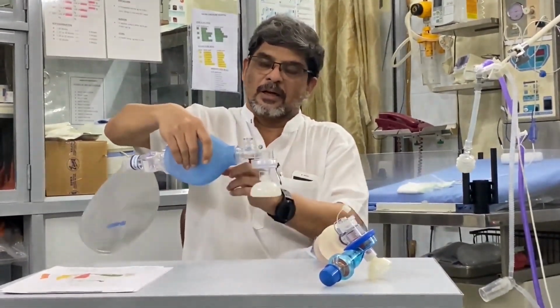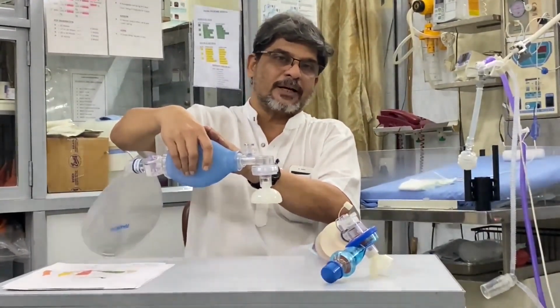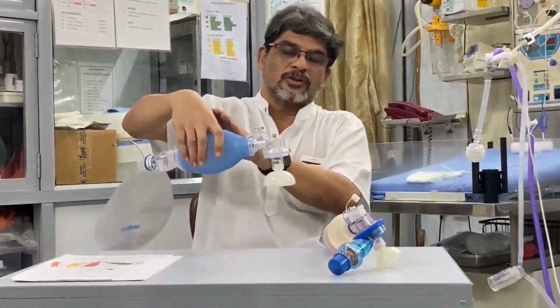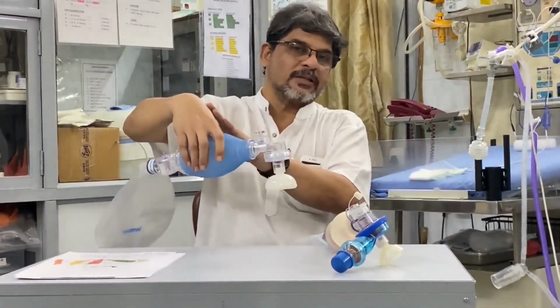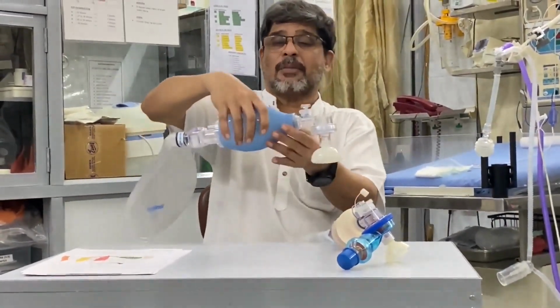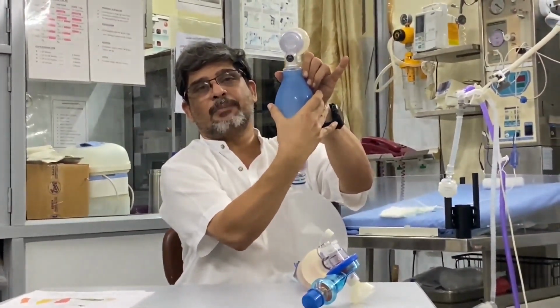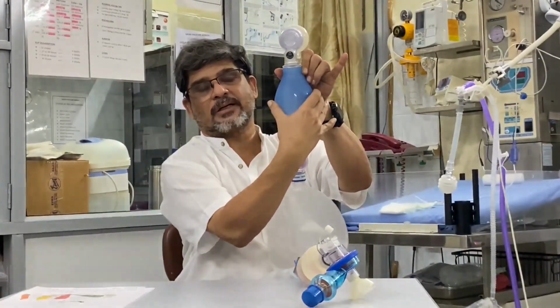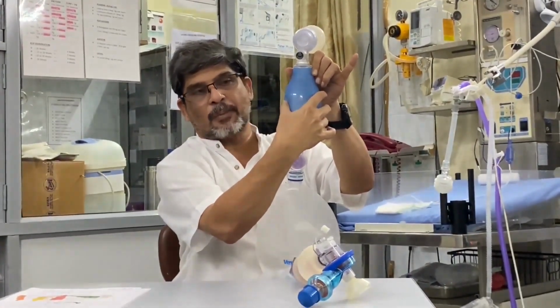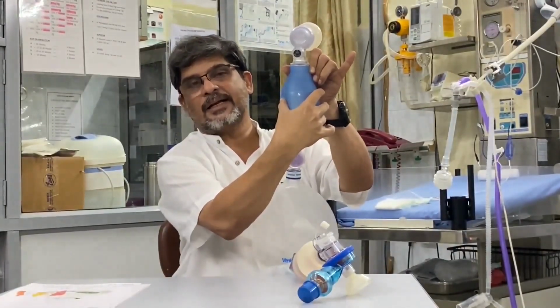After giving the pressure, how long you maintain the inspiratory pressure determines the inspiratory time. After that you release the bag. This is the expiratory phase, and the time taken for expiration determines the expiratory time. The pressure at the end of expiration, if you release the bag totally, is zero. If we give the inspiration and don't allow the bag to empty completely, maintaining some amount of end expiratory pressure, it is known as PEEP, positive end expiratory pressure.